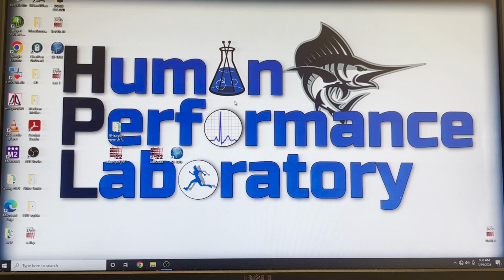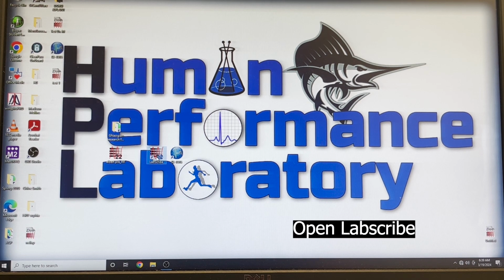In this video, we're going to walk through how to use the iWorks software and hardware to measure heart rate variability. To start off with, we are going to open our LabScribe software. We'll double click here on our computer.